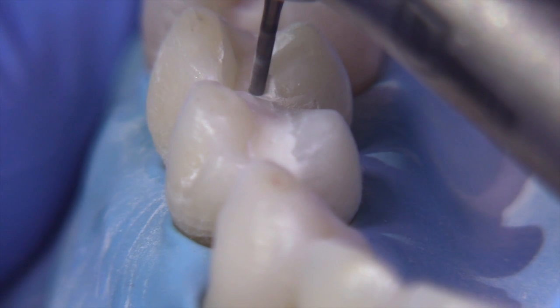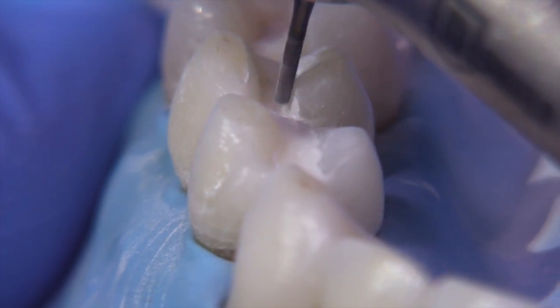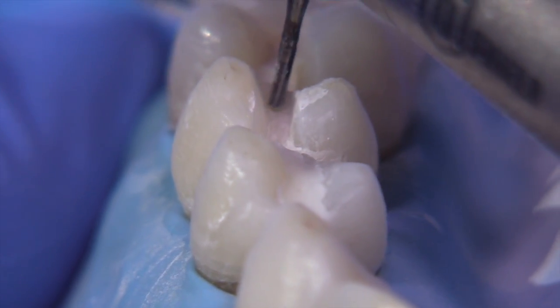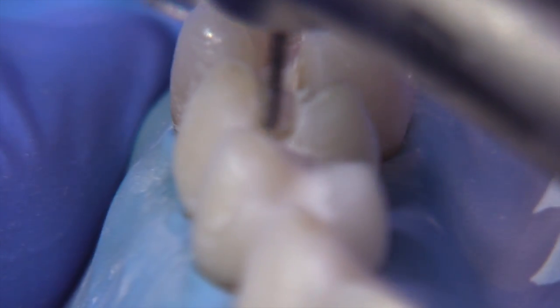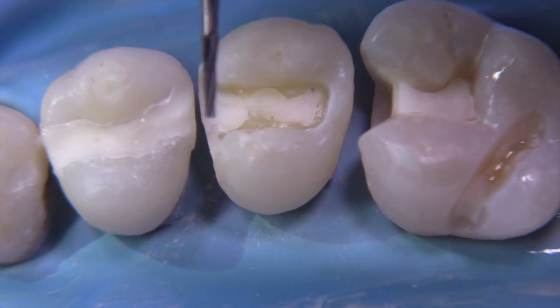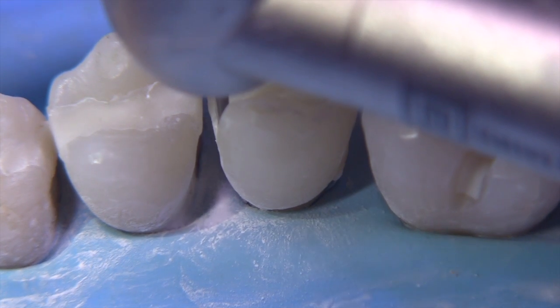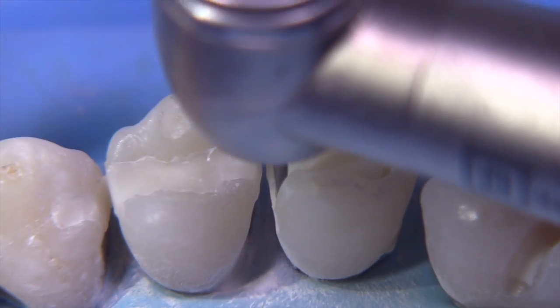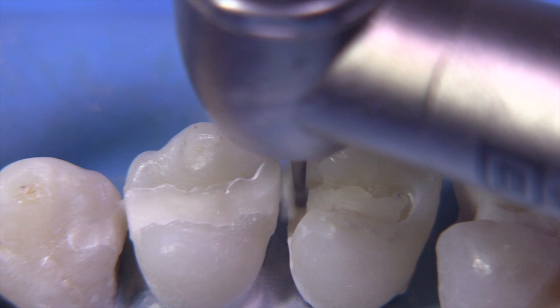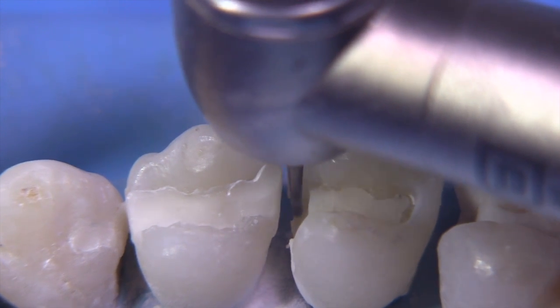Part of the occlusal outline would be to generate the exit angles or the flares in this particular case. We'd like to get the flares started first and then follow those flares when we drop our box. Here's the 169L ready to drop the box. We are going to start with a very narrow preparation in this area and then widen it gradually until we meet the existing occlusal walls that we've created in the initial step.